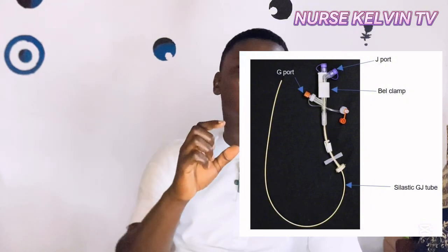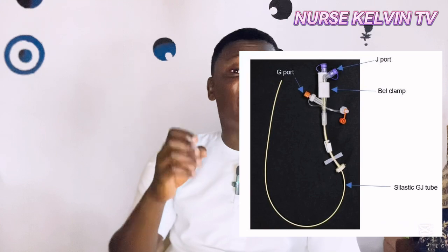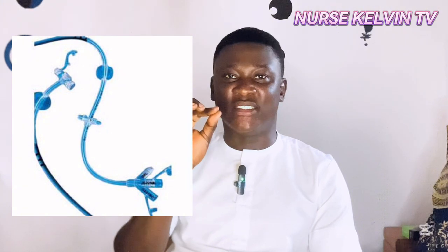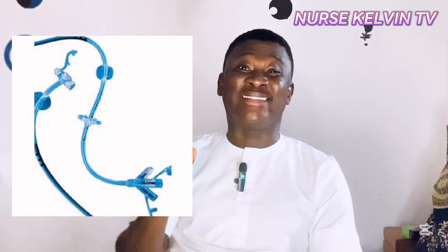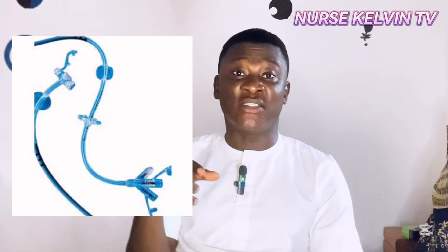Mostly when the patient undergoes surgery, or when there is a severe reflux case and the patient cannot tolerate it, that's when we pass the jejunostomy tube. It is inserted directly into the small intestine.